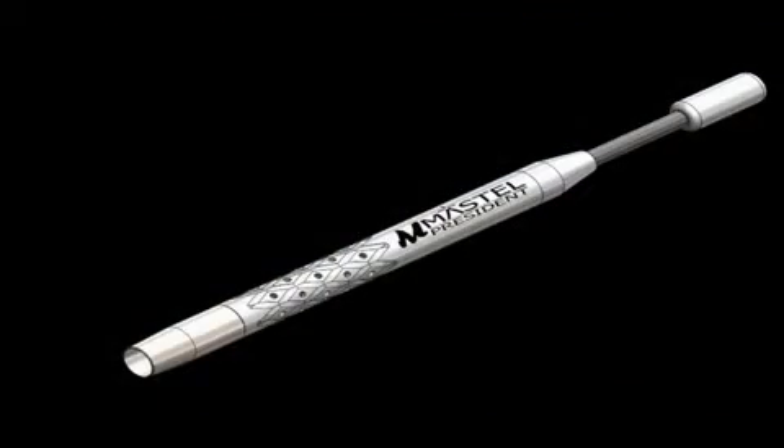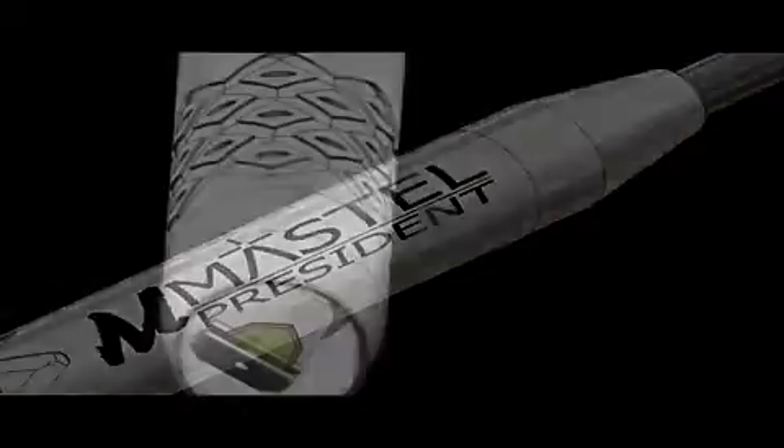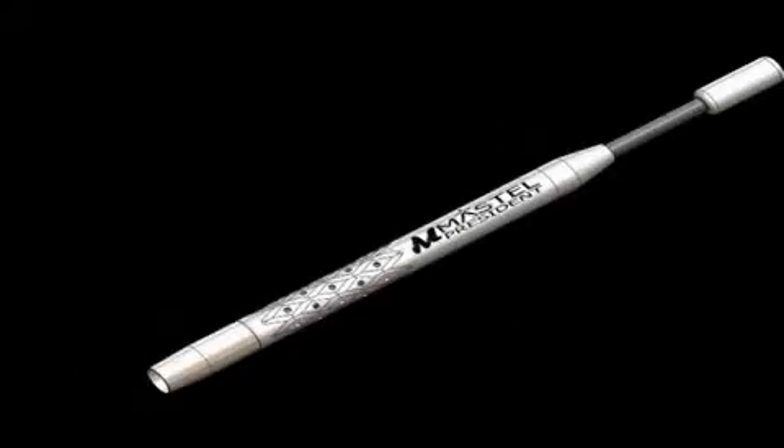Your new diamond has been mounted in the President series handle. This handle has stood the test of time for surgeons worldwide. The titanium body is designed to resist corrosion and mechanical failures. Unlike other scalpels, there are no springs within the body. Springs are typically the first parts to corrode and fail.